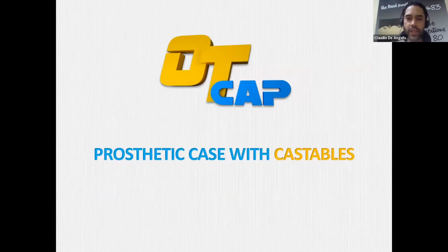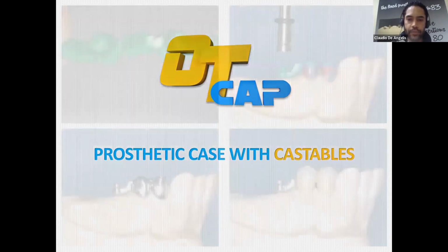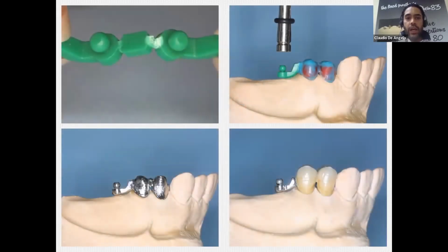Let's see a prosthetic case with castables. It's a very simple attachment. In the laboratory, you break the bar, the one with the angled arm, and according to the occlusal plane, you always need to understand which is the occlusal plane of the patient, and by means of a parallelometer, you place your attachment in the distal area of the crowns, to be cast.